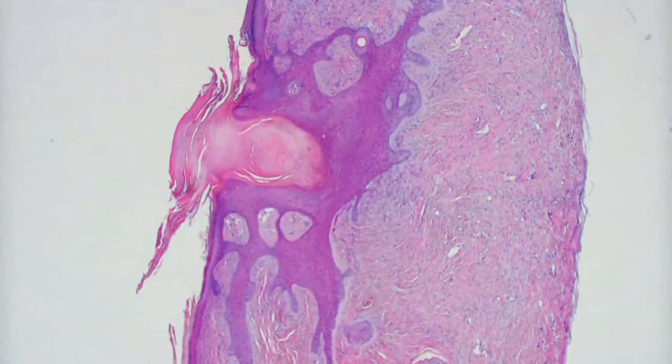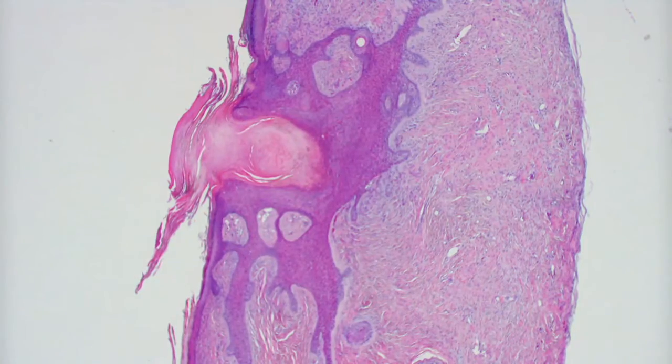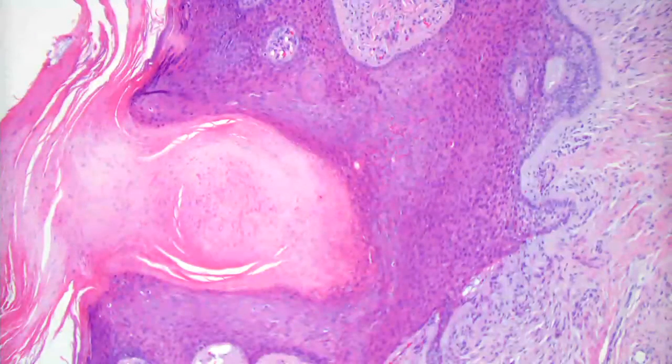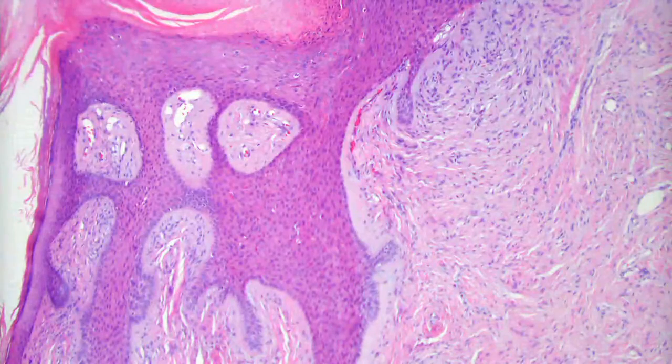What I thought was most interesting is that it had this little mantelloma. So this is a little benign follicular proliferation of the mantle zone. These are forming little primitive follicular structures here, kind of papillary mesenchymal bodies. It's not really a trichofolliculoma. It looks a little like a trichofolliculoma with the stroma of a fibrofolliculoma, which is fascinating. So this is what you see in patients that have Birt-Hogg-Dubé, obviously.